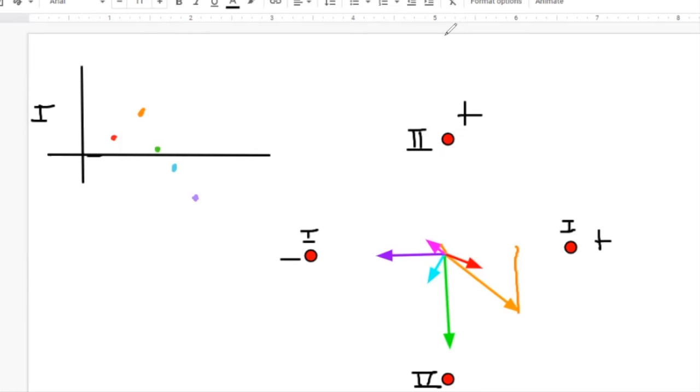James, what's it going to be for the pink one in lead 1? I'm going to say negative. Large or small compared to purple? Small. Okay, so then we can see how this traces out a signal, and it looks maybe kind of QRS-like. I might have put the spacing out too far. Does everybody see that? Just to solidify it, we're going to do it one more time for lead 2 and see how they're different.